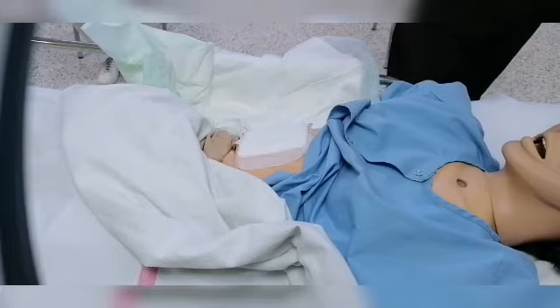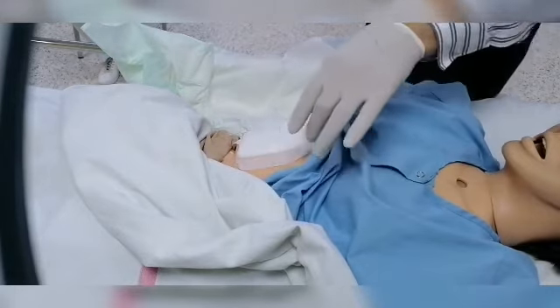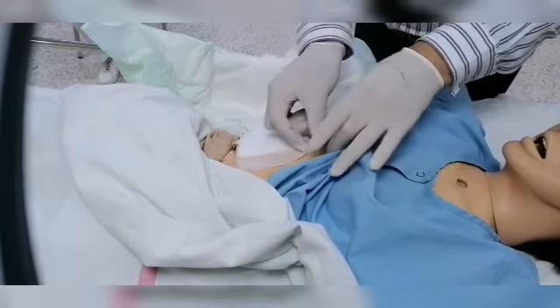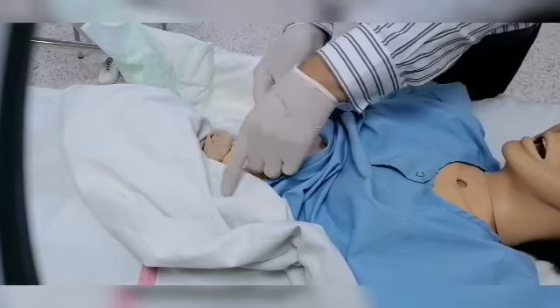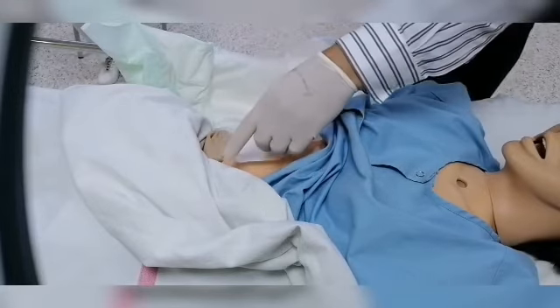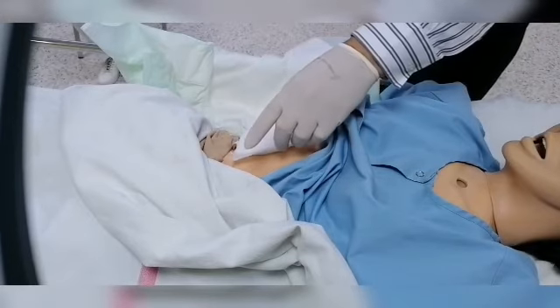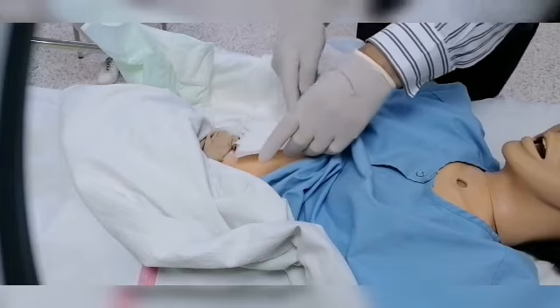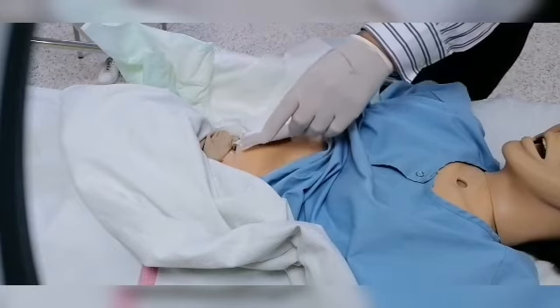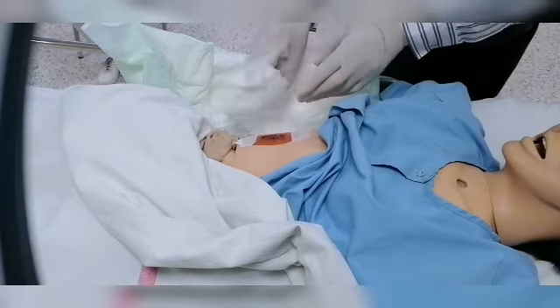Then I will take out the previous dressing. I will start with the plaster. If the plaster is stuck there, I can loosen it with normal saline. I can use normal saline to make it wet, and by that it will come off more easily.